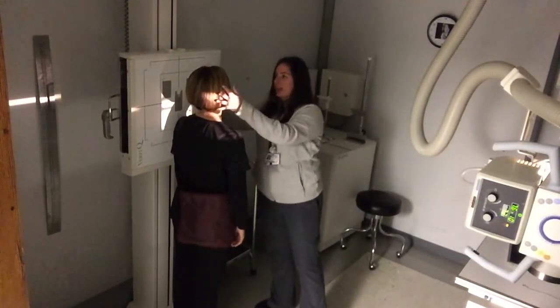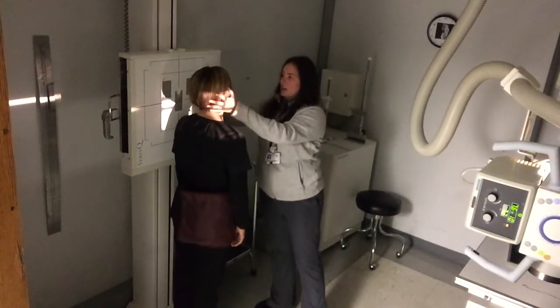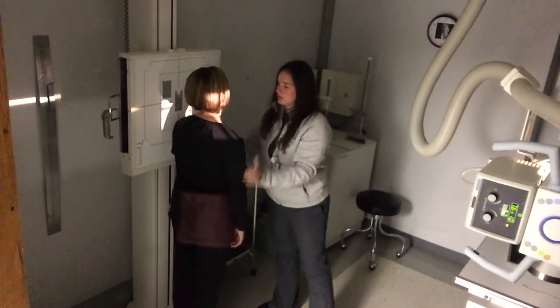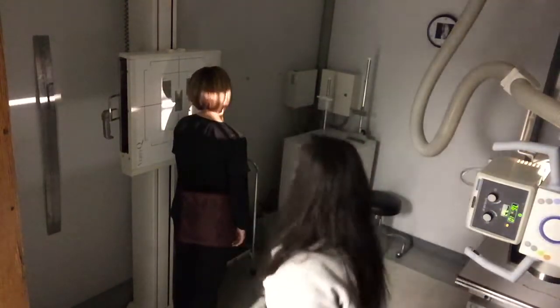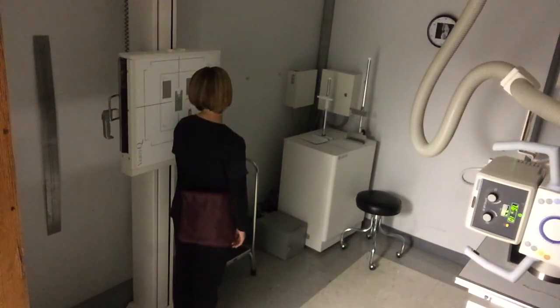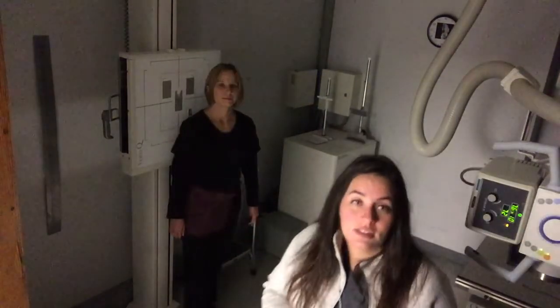You also want to make sure their head isn't tilted towards the IR or tilted away. Nice and straight here with their chin up. And then you want them to really relax their shoulders down. Sometimes I go like that to kind of give them the emphasis to do it. I'll set my technique once again at 85 kVp, and I will have them blow all their air out, relax their shoulders down, and expose. Very good. And that's the 3 projections we will do for C-spine.